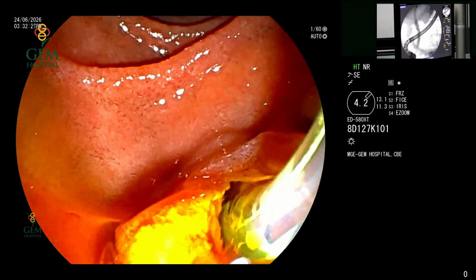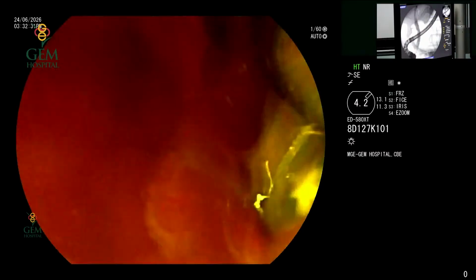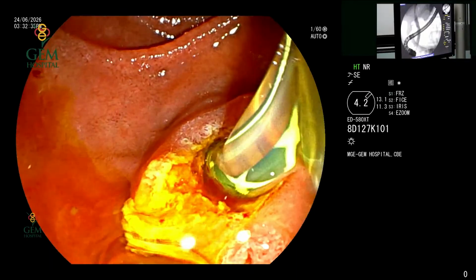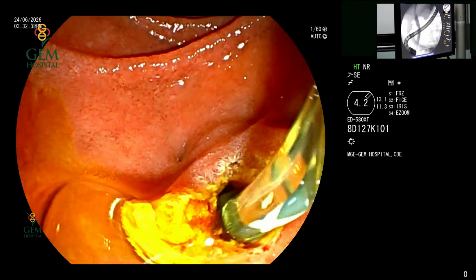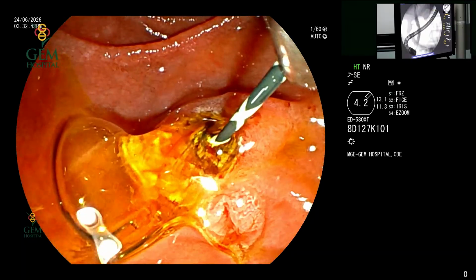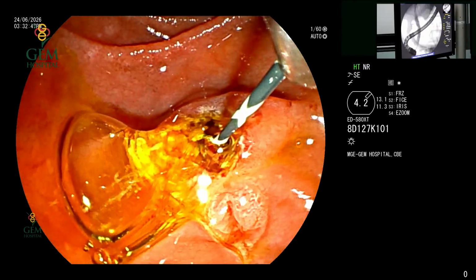The cholangiogram shows the CBD and the CHD of a similar size. So we have a dilated biliary system where the common bile duct would be around 10 to 11 mm in size, and we can notice a small filling defect, possibly in the distal CBD. The CBD is dilated and there is a smooth tapering of the distal end.